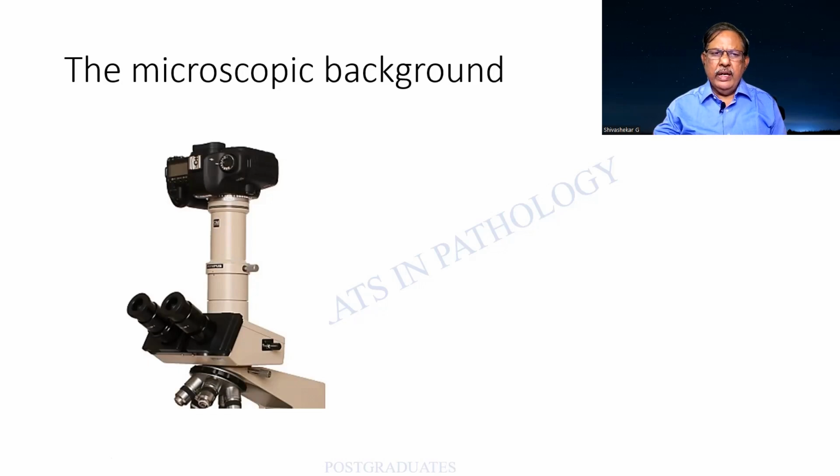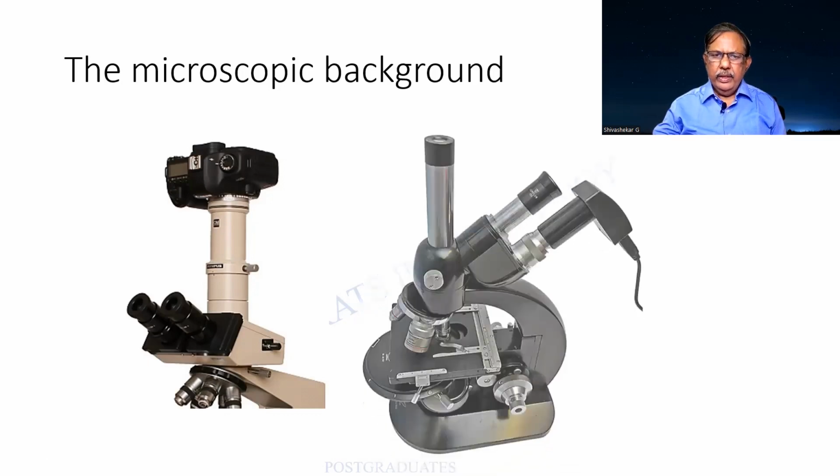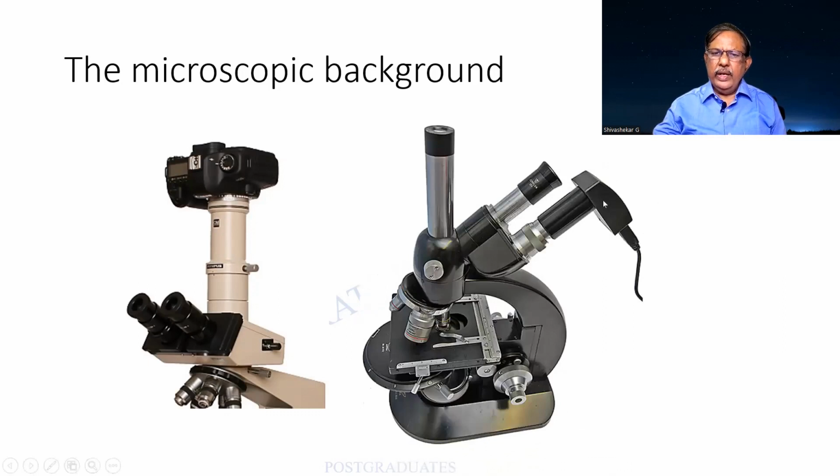You will have an eye viewer or a vision that makes it possible for us to focus, after which the camera clicks, so that you get a picture of wonderful resolution, like what has been seen in the earlier WHO transparencies, etc. Also, nowadays the digital camera can be attached to one of the eyepieces over here or to the trinocular microscope.